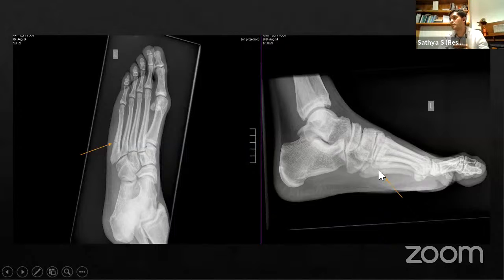I thought of showing you how X-ray is so beneficial for understanding the different views, like an oblique view and a lateral view, shown here, and we can see clearly how this fracture appears in this area. We can also see how the subtalar joint is present, and how the talus overlaps the calcaneus anteriorly, so sometimes we are unable to see the anterior process of the calcaneus.